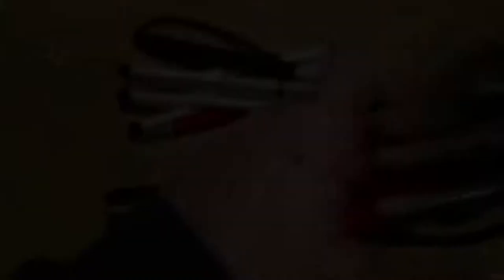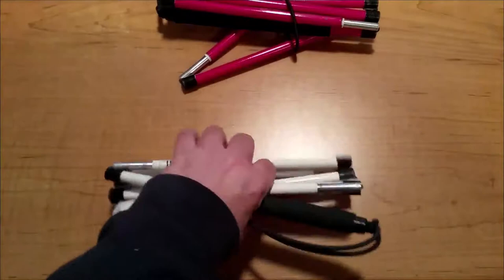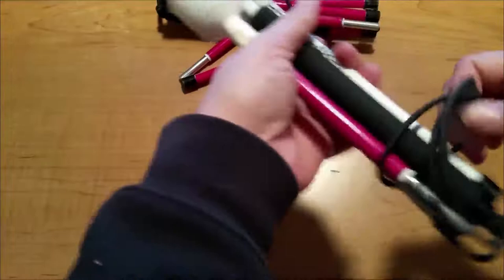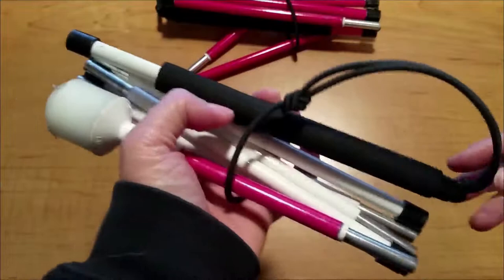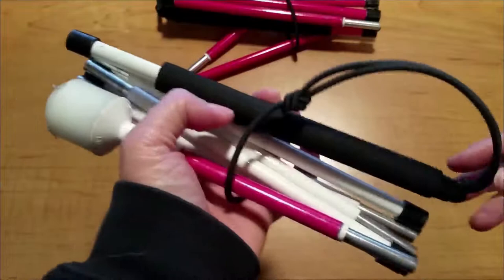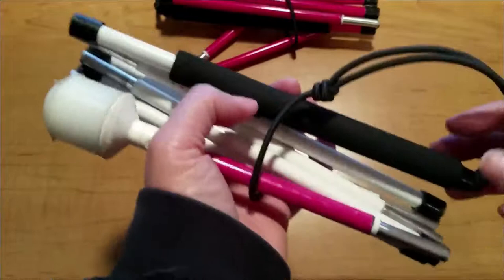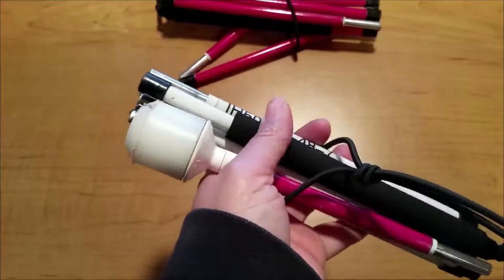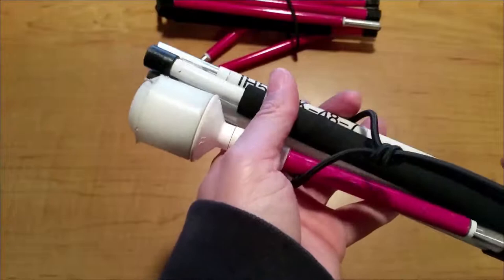The last downside to the slimline canes is the grip — the handle. On the slimline canes it's only available in black foam. This was quite a disappointment because when I ordered the cane it said highlights would be pink, so I thought I was going to get a pink handle. It turns out the colored handle is only available for the aluminum and regular graphite types of canes. The AmbuTech website specifically states that the slimline cane is only available with the black foam handle, so just bear that in mind.